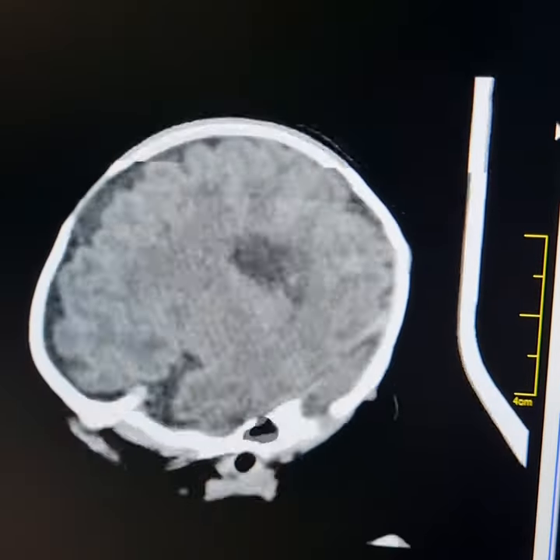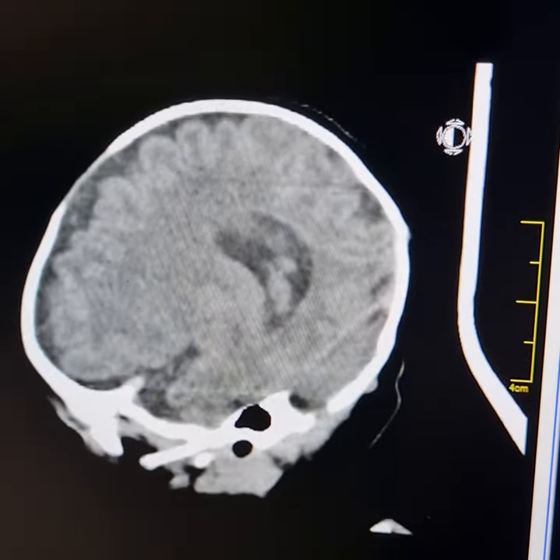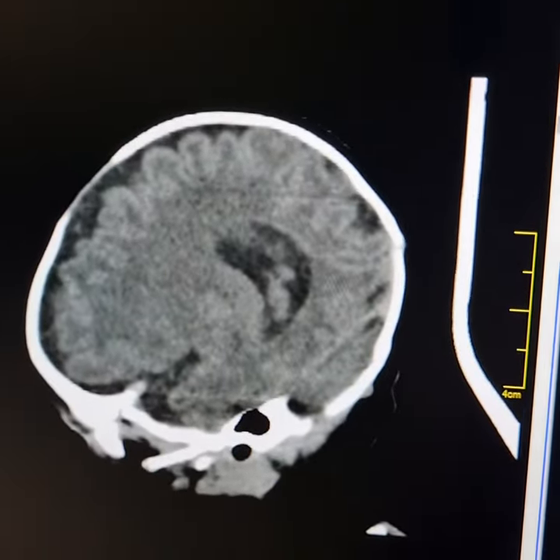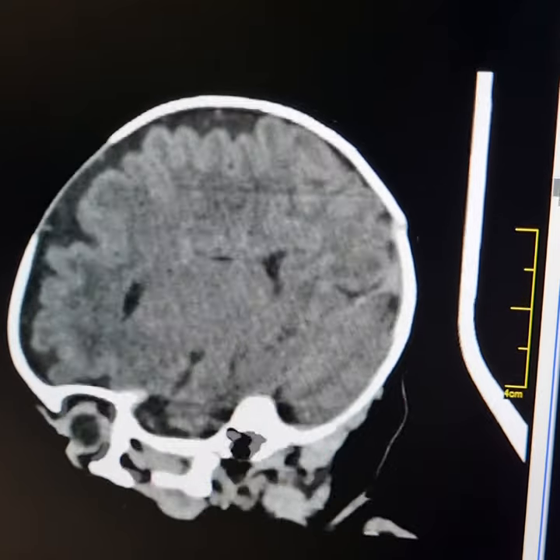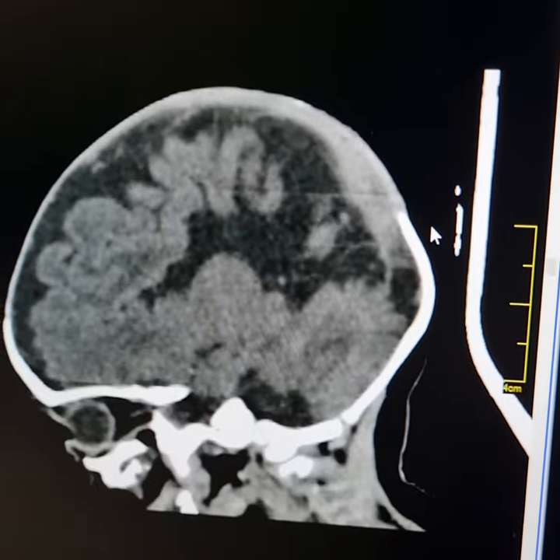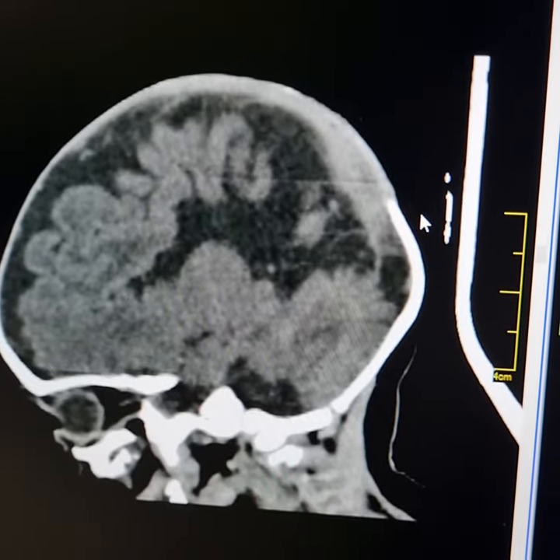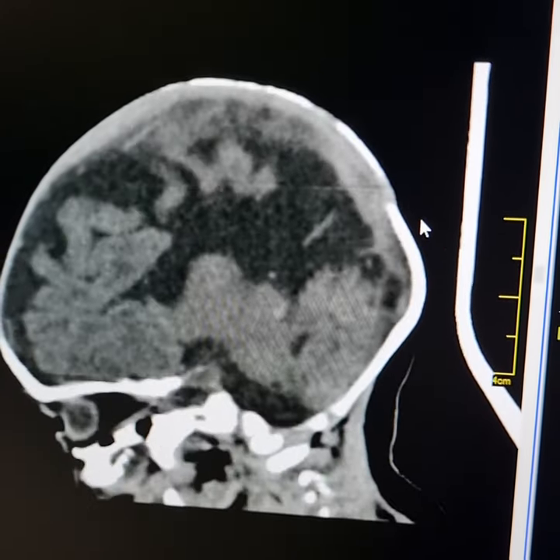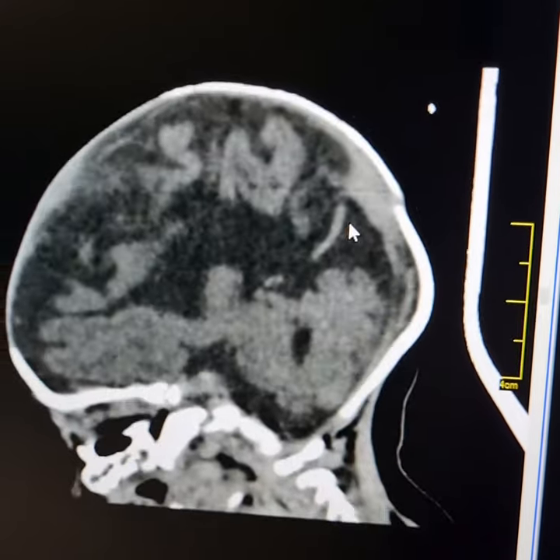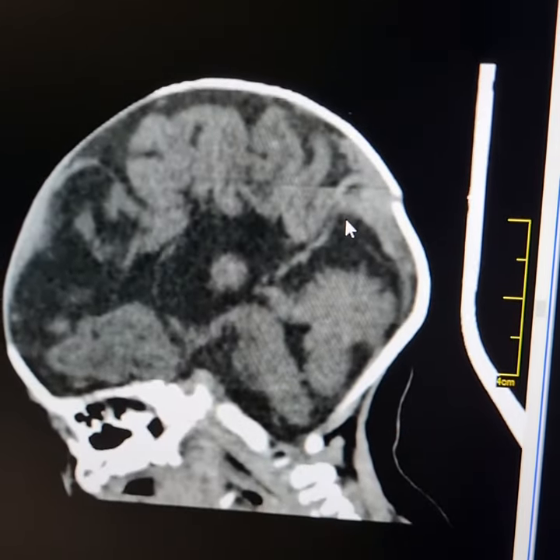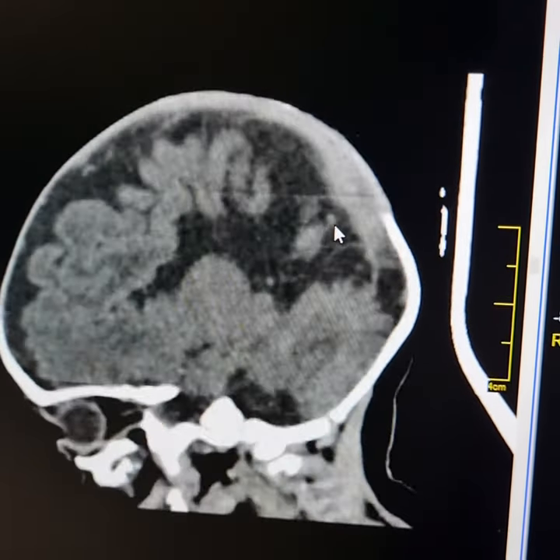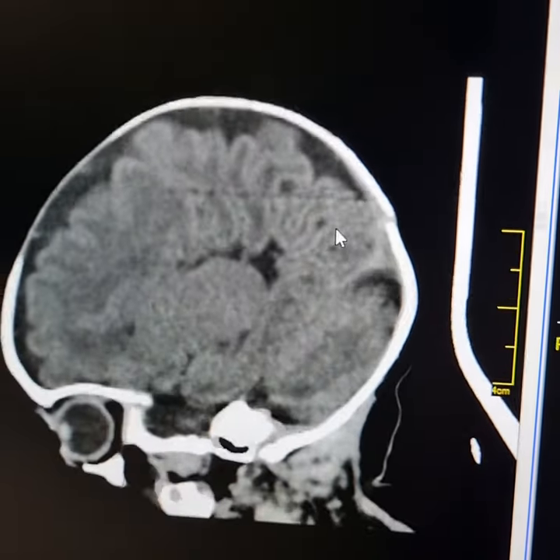This is the sagittal scan. Very typical findings of corpus callosum agenesis — you do not find any corpus callosum in the midline.